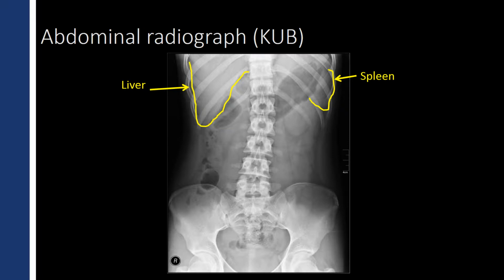But radiologists, believe it or not, are not perfect, and sometimes you can see things that radiologists don't see. And in any case, you're not always going to have a radiologist right there on the spot that can interpret your x-ray for you. You may be working in a quick care clinic where there's no radiologist available, for instance. So anyway, look at your own films.